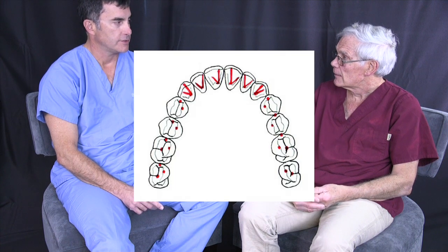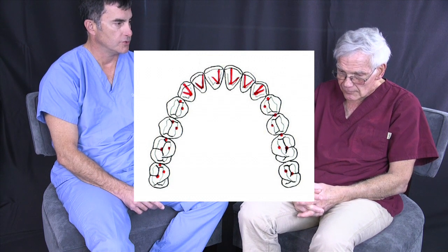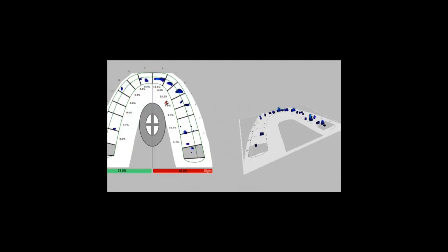increasing the disclusion time. Now, the old term: dots in the back, lines in the front. We in dentistry have all seen that classic supposed ideal occlusal design. What is your feeling in regards to those lines in the front? Those really are representing a concept of disclusion time. The lines themselves are the moments of contact, or expression of the moments of contact, as we're going toward an excursion to the left or right, or protrusive.